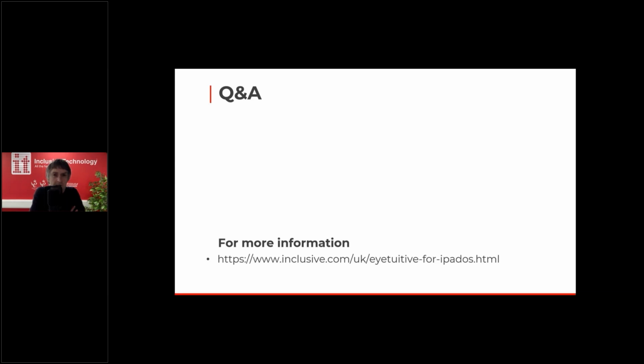We don't offer any trials ourselves, but that's probably a difficult question, it's very user specific. It's as good as Toby, as you saw with the demos. It certainly does as much as Toby in terms of the Snap to Item and the kind of apps that you can access with it. So hopefully the demos and the videos and the case studies that you saw go some way to answering that question. I think we've got a few more questions here. Let me just have a look at these now.